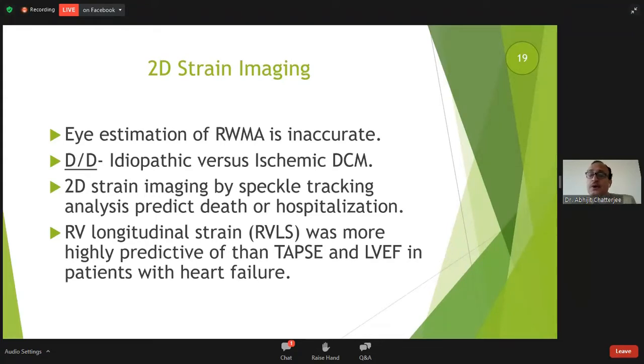Now, what I am saying now is from the American Society of Echocardiography's Comprehensive Echocardiography, 3rd edition, which was published earlier during this current year. What is normokinesis? More than 30% systolic thickening. What is hypokinesis? 10 to 30% of systolic thickening. What is akinesis? 0 to 10% systolic thickening.